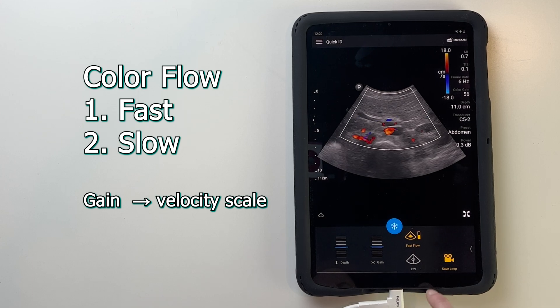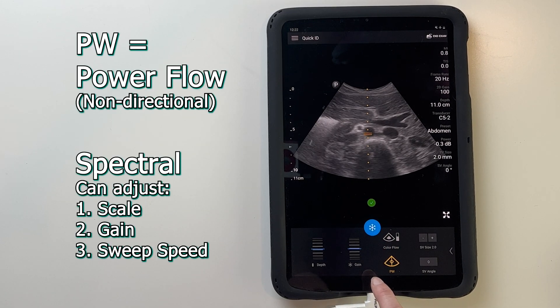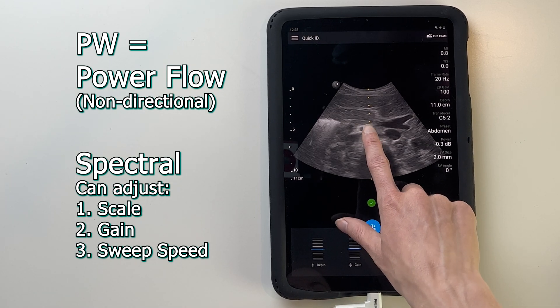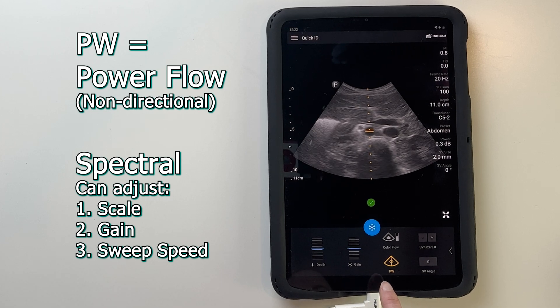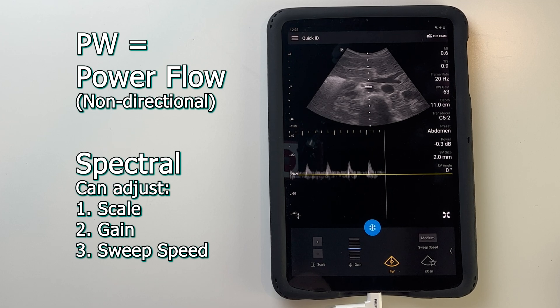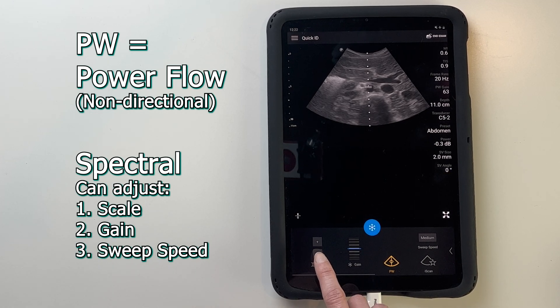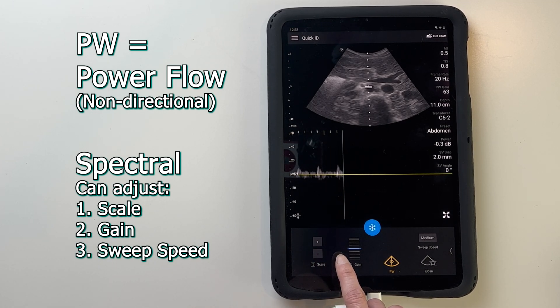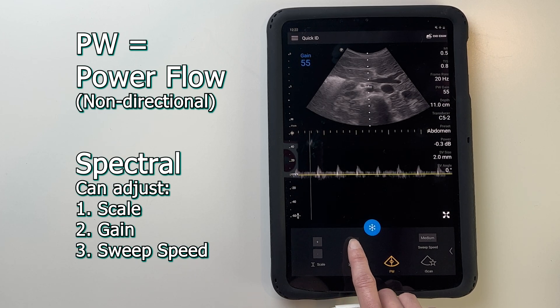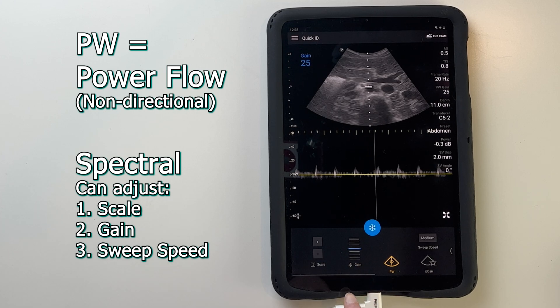When in color mode, the gain wheel will adjust your velocity scale. At any point, you can record a 5-second video clip with the save loop button, though the length does not seem to be adjustable. After hitting the PW button, you can use one finger to change the location of the sampler, then hit PW again. This brings you into a spectral Doppler setting, which displays a graphical view of velocities, where you can adjust the velocity scale and gain. Note that the grayscale image is frozen during sampling, so be sure not to move your hand and misalign the sampling region.